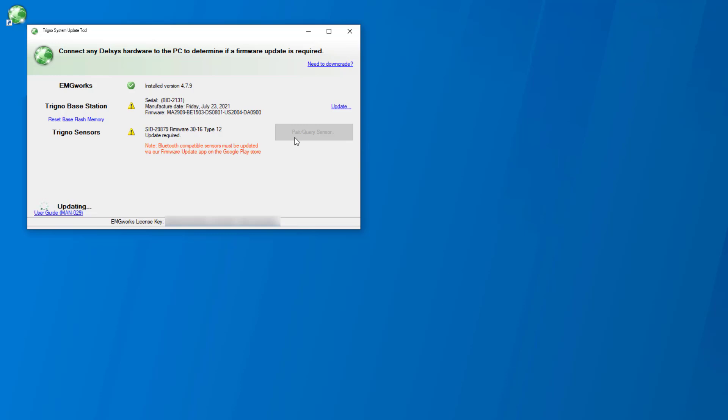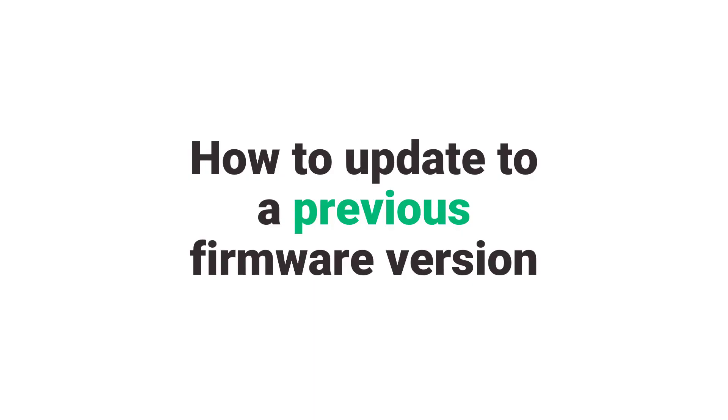Once finished, the updated firmware version can be viewed in the Trigno sensor section. Please dock the sensor in the charger. Repeat the check and update steps for any additional sensors.